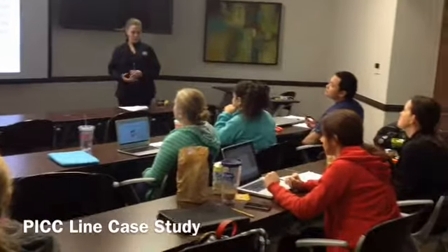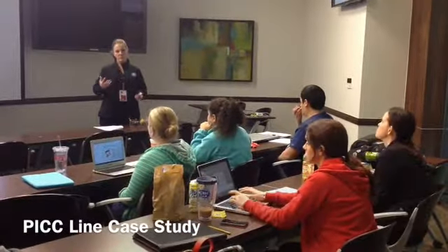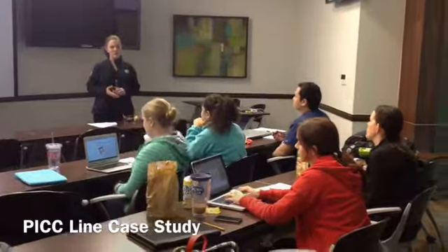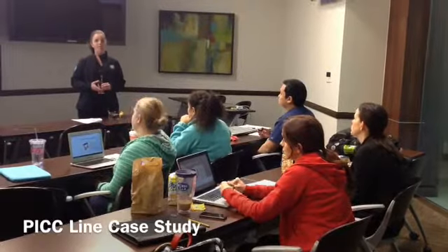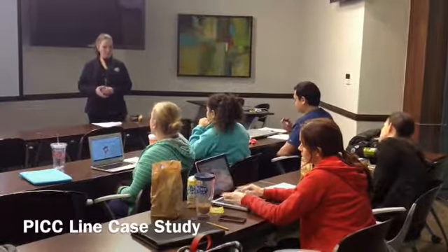Possibly an infiltration. So we couple that with sluggish. We weren't able to fix anything with all the troubleshooting strategies that we did. Could be a clot. Exactly. Okay. So what do you do next?